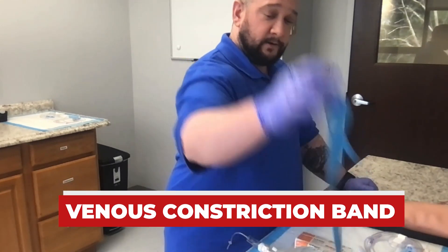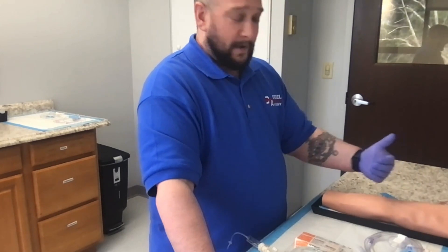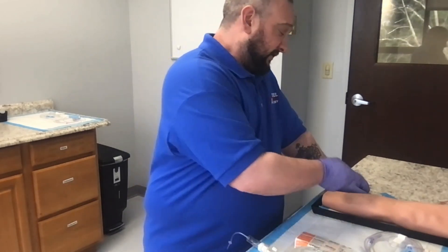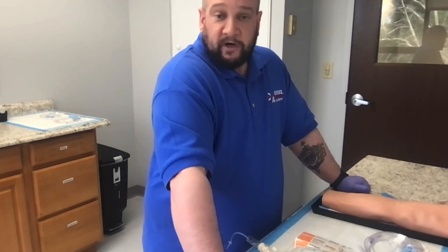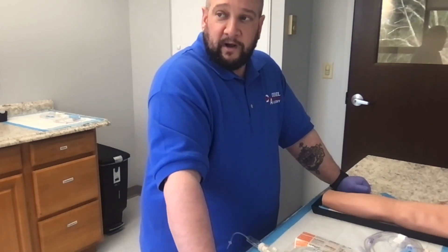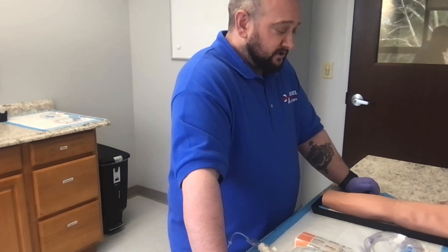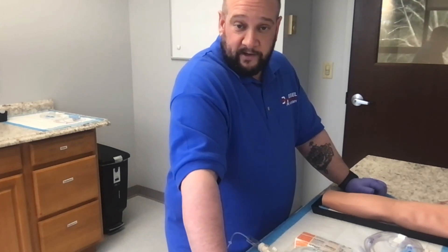You're going to have your venous constriction band. Let the patient know before you apply it that it's going to get tight. The purpose is to create back pressure so veins become more engorged and rise closer to the surface. If you're having trouble finding a vein, try heat — a heat pack or gentle rubbing. Heat causes vasodilation, bringing veins closer to the skin surface and making them easier to palpate. You can use more than one venous constriction band to get adequate pressure if needed.